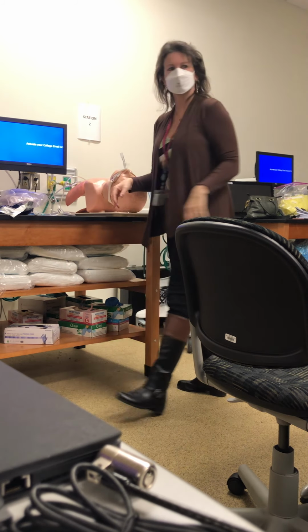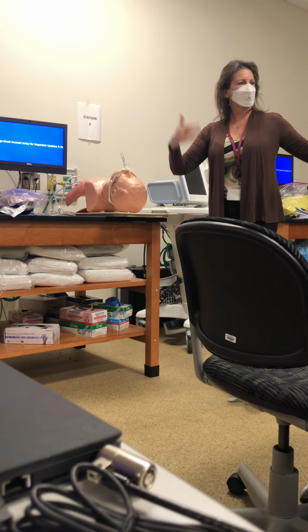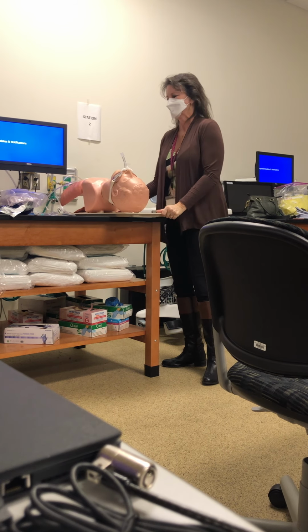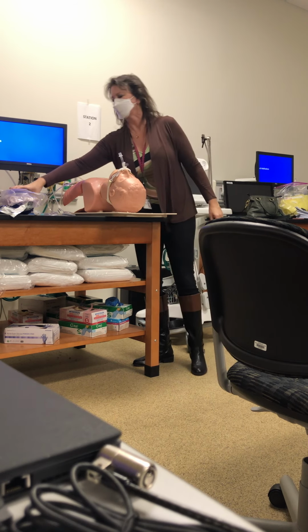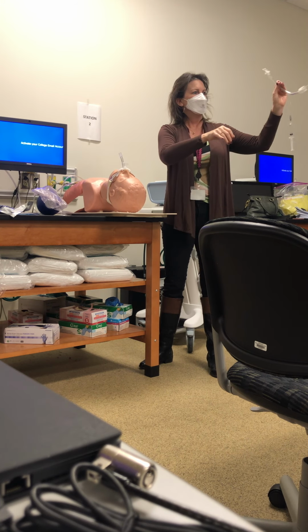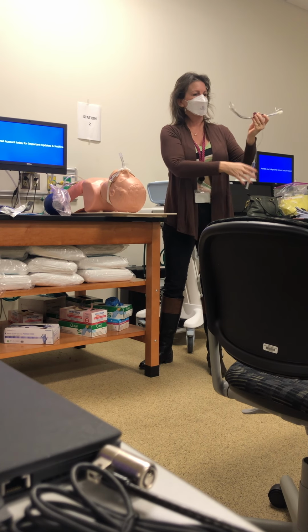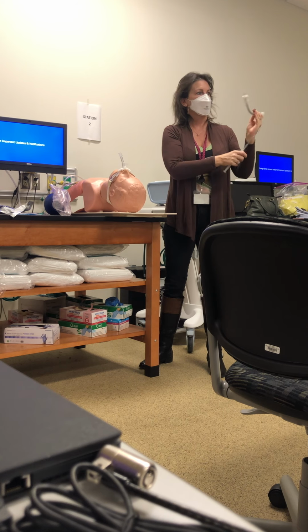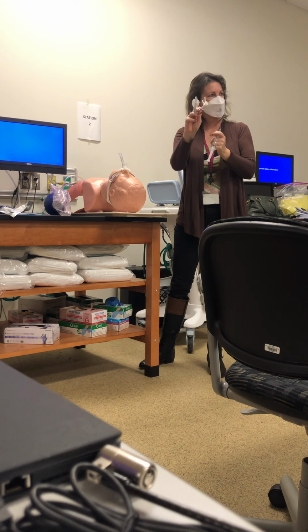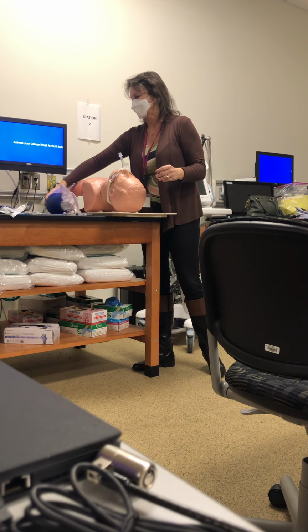Okay? Can everybody see me? If you can't, you might want to gather around. Just stay a distance because y'all don't have gowns on, but just so you can see. Everybody can see? Okay. So what's the first thing I want to do if I'm getting ready? What's the first thing I did? I checked my tube, right? Make sure my cuff's inflated. I want to make sure it's deflated all the way down before, right? And you can lube it up. Okay, so it's back in its packaging. Okay, so that's sterile. Now what do we want to do?